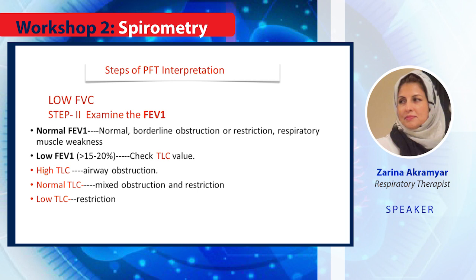If FEV1 is low also, then we look at the TLC. If the TLC is high, it will be obstruction. If normal, mixed obstruction restriction. If low, restriction.